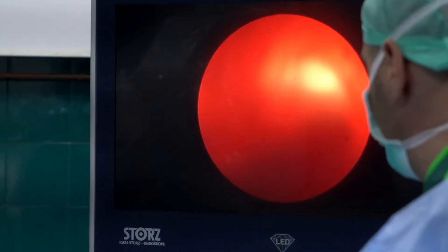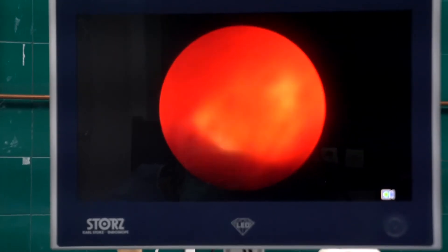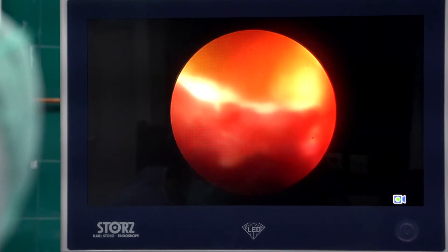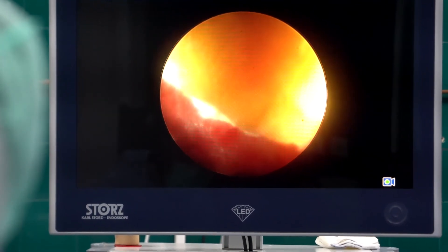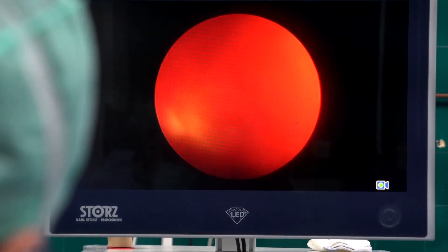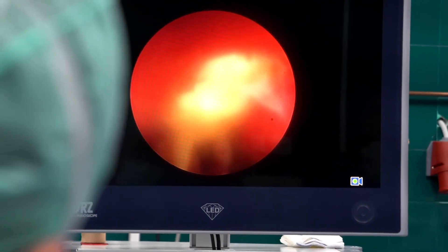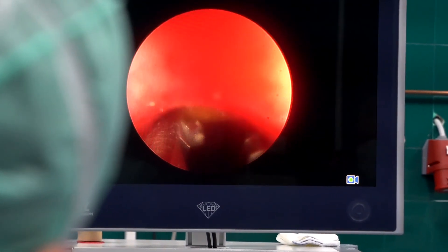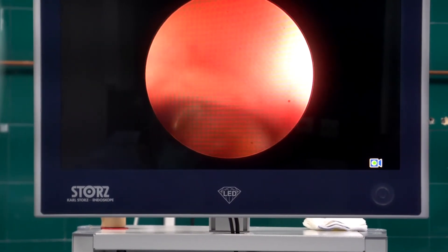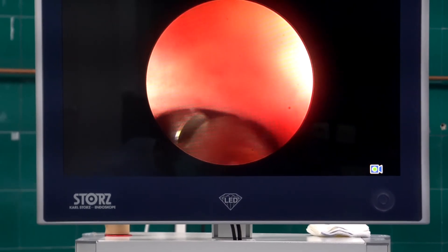Ballistic lithotripsy is also efficient, especially for harder stones. We are taking out the fragments — in this case we are performing surgery in the supine position, so we can take the fragments out from inside the system using the vortex effect, just pushing the fragments out. By pulling the sheath, fragments can be easily evacuated from the system and we don't always need to use the grasper.